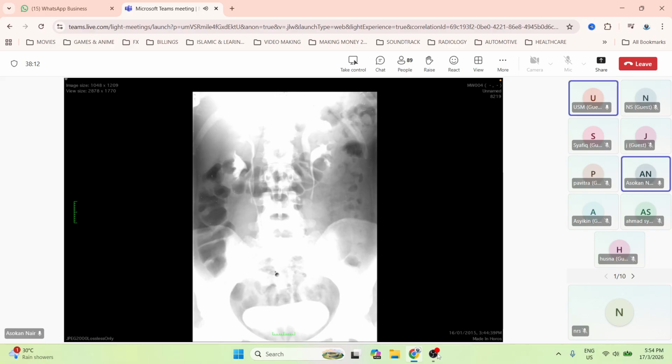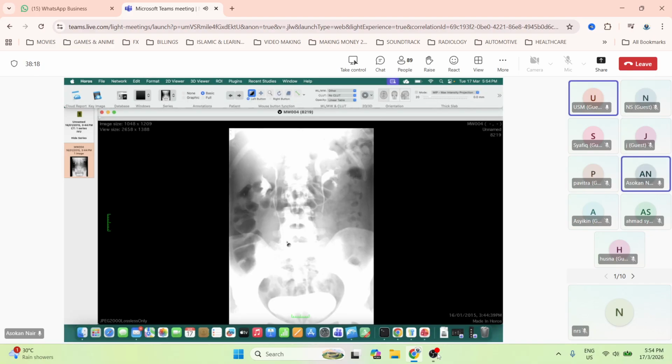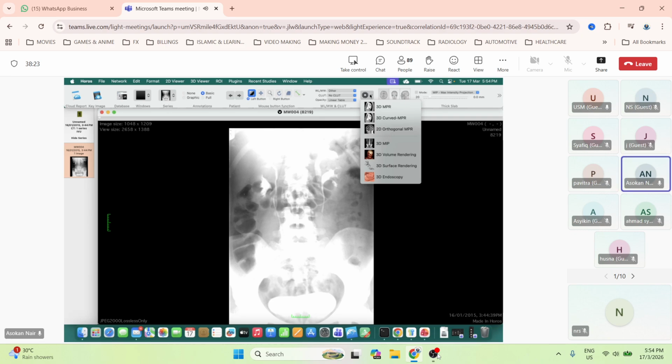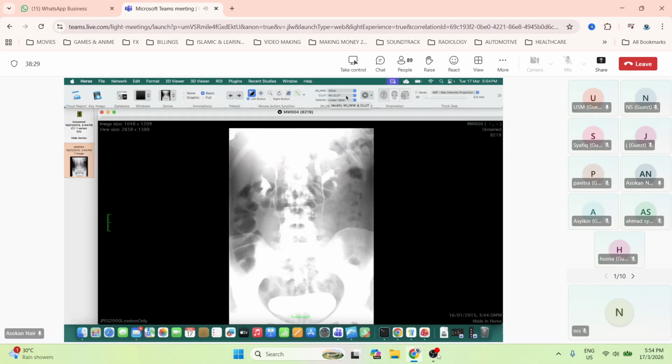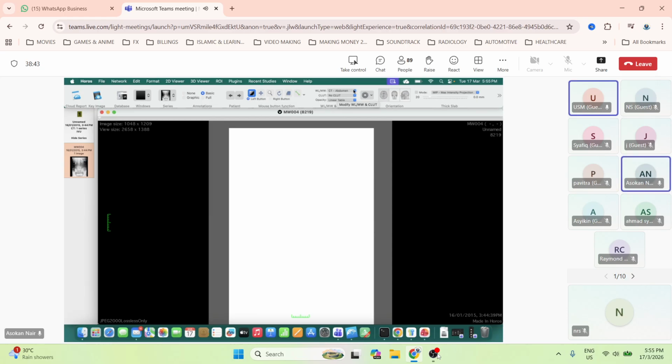What happened here? Any ureterocele, okay? See if I can get it. Everything is gone now. Never mind. Okay, so that's all about duplex.